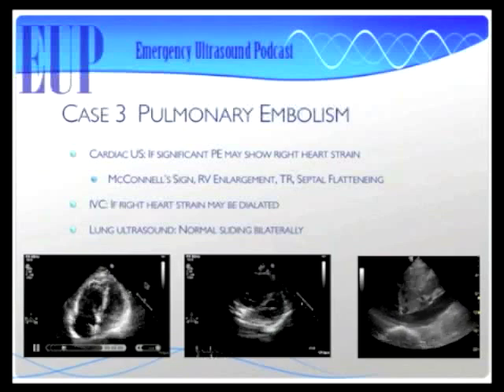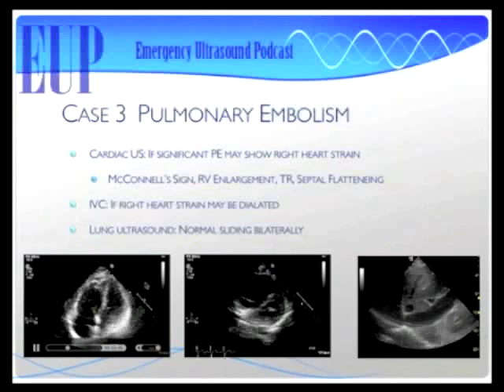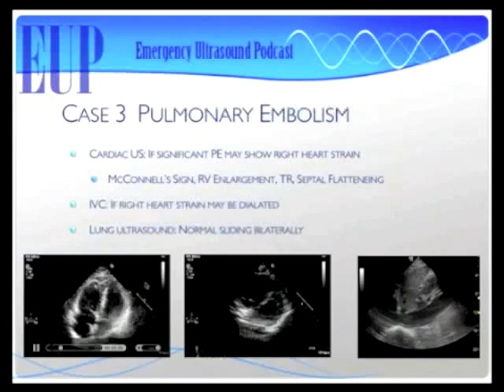So those are 3 cases, and hopefully you got something out of it. Was that interesting for you? That's amazing. Those are cases that, with my 2 liters and see what happens strategy, they may not have done so well, but now you've given me tools to actually accurately diagnose. And you say this takes minutes? Hey man, that's what I'm saying.